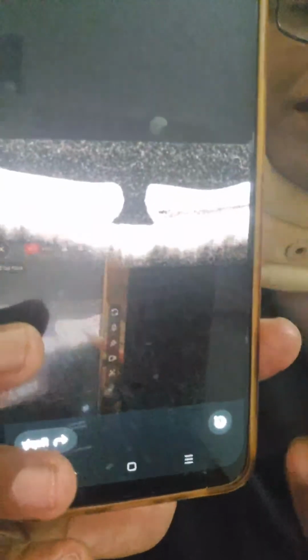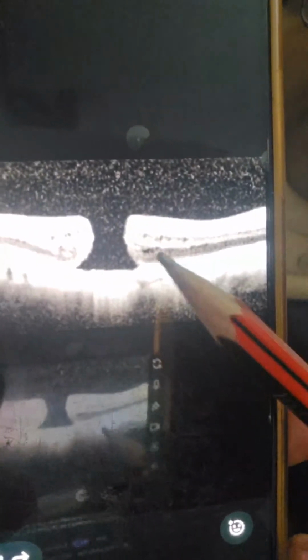Good evening, Vinod. Yes, very good. This is an OCT, optical coherence tomography. Yesterday in the retina quiz, there was a question which asked which investigation lets you visualize all the layers of the retina. I can see all the 10 layers of the retina and a full thickness defect in the retina. In fact, I can see a little bit of the choroid and a little bit of the posterior vitreous. So the investigation is OCT.